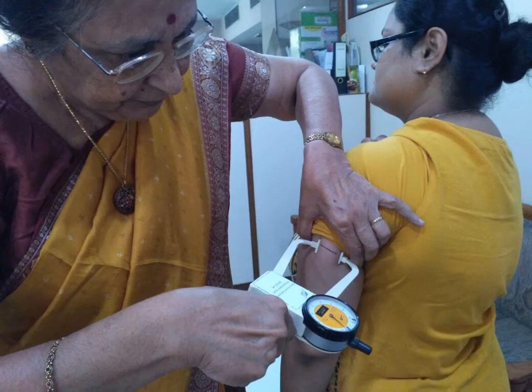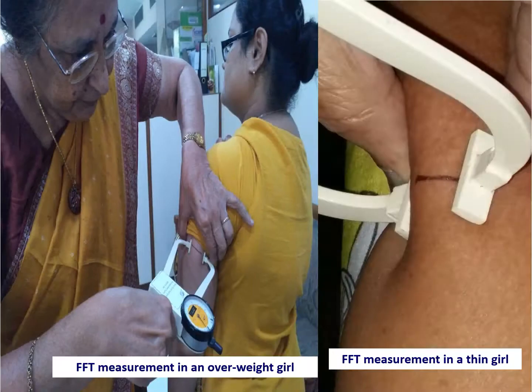Once the fat fold has been picked up, the Harpenden caliper is to be inserted at the level of the mid upper arm circumference indicator and steadied. Once the reading is steady, the reading on the dial is to be taken.